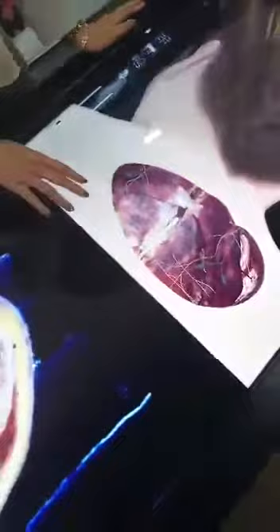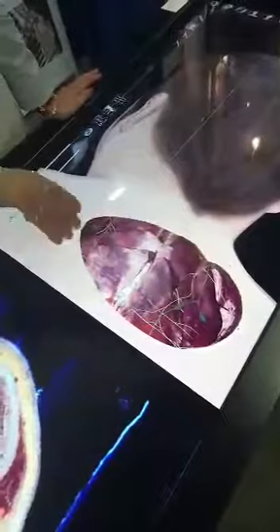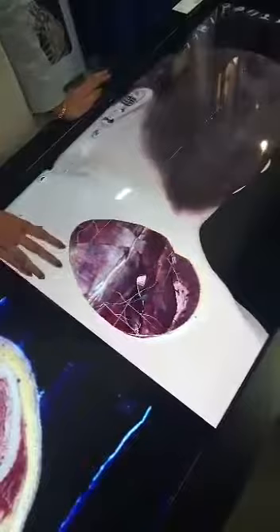If you don't want to look at the anatomy as a whole, you can also see regional anatomy. In this case I have the female head and neck. To mimic something that you'd find in surgery, you can also do natural cuts — in this case I have an incision made and you can also see the relationship between the skin, the fat, and other structures. And as I showed earlier, you can go ahead and also remove structures here and press the undo button.